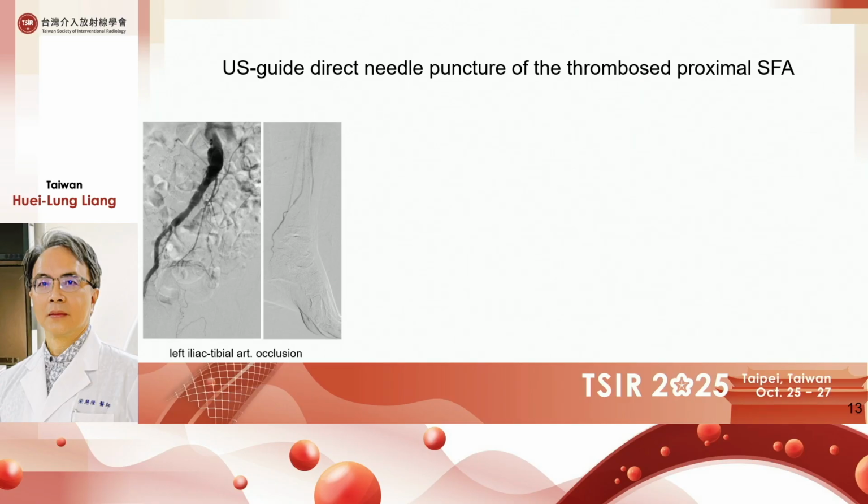In this patient, total occlusion of the left iliac artery, common femoral popliteal artery, and the run-off vessels. The left iliac artery could not be crossed via the right femoral approach.